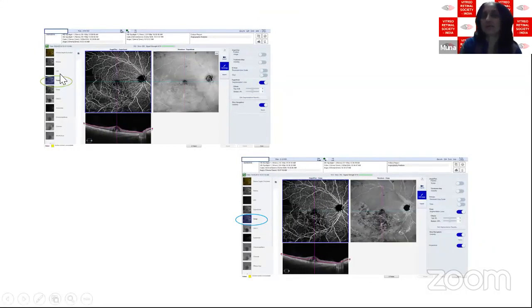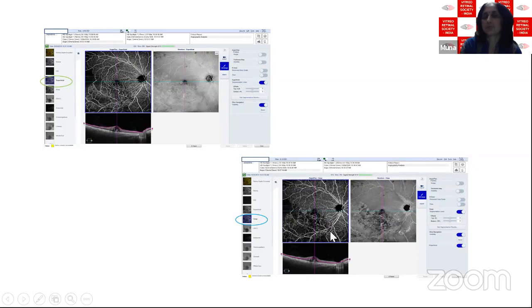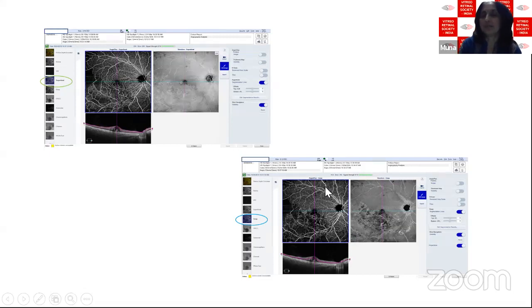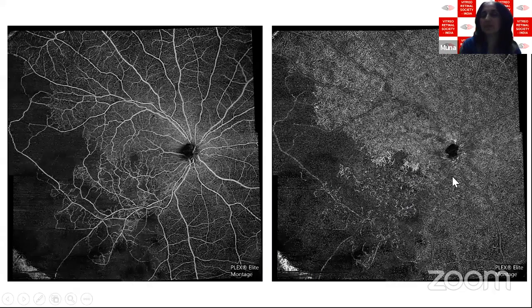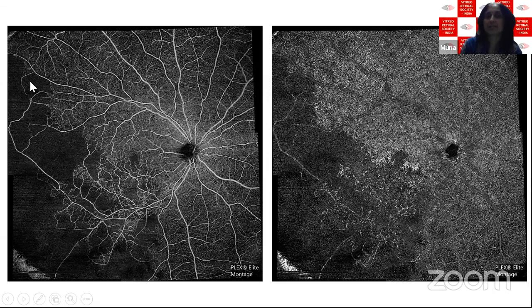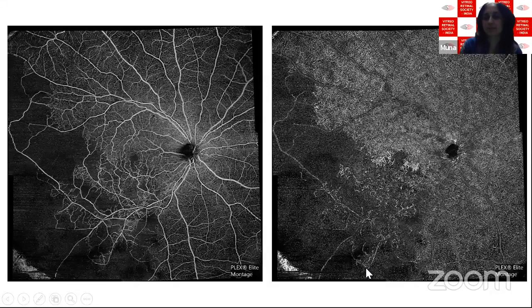In a branch RVO case, the superficial capillary plexus shows large areas of non-perfusion indicating ischemia, corroborated by cystoid spaces on structural OCT. In a central RVO case, vessels are dilated and tortuous on the en-face image. Changes in retinal vein occlusions are more obvious in the deep capillary plexus than the superficial. Most machines offer 3×3mm to 6×6mm scans; newer machines like the Plex Elite with swept-source technology provide 12×12mm montage scans showing entire non-perfusion extent, with more dramatic changes visible in the deep plexus.